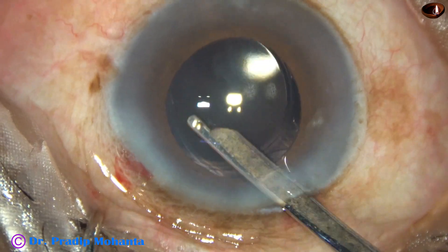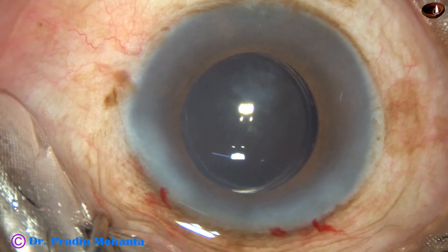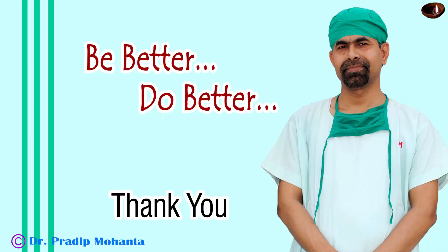After the final lavage, the anterior chamber is nicely formed, IOP is kept on the higher side, and we conclude the case. Thank you very much for your attention. Hope this video will help you in learning direct chop of nuclei in grade 3 nuclear sclerosis. Be a great surgeon and serve your patients with love, respect, empathy, and great surgical competence.